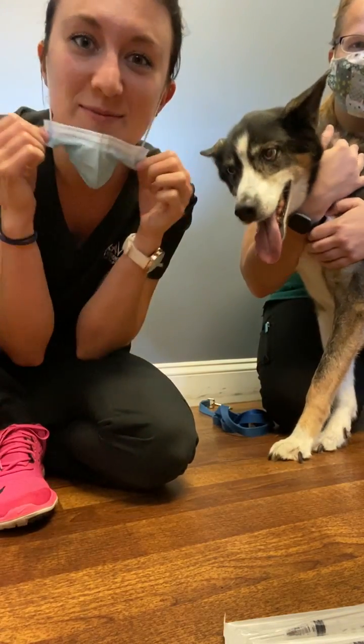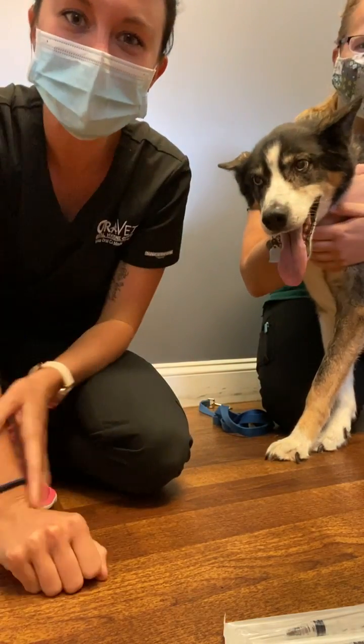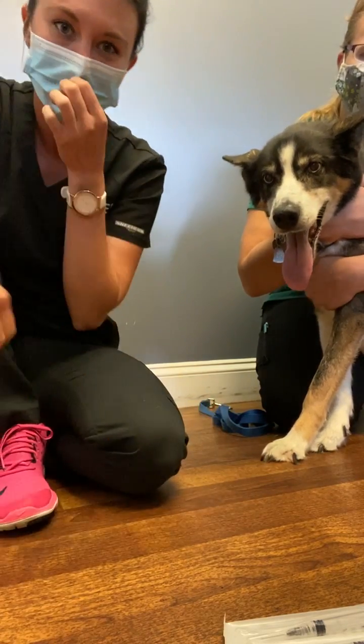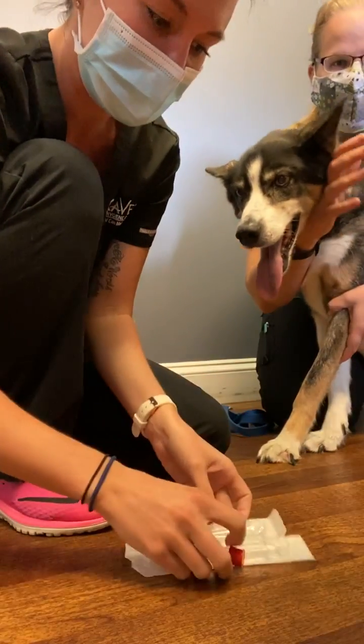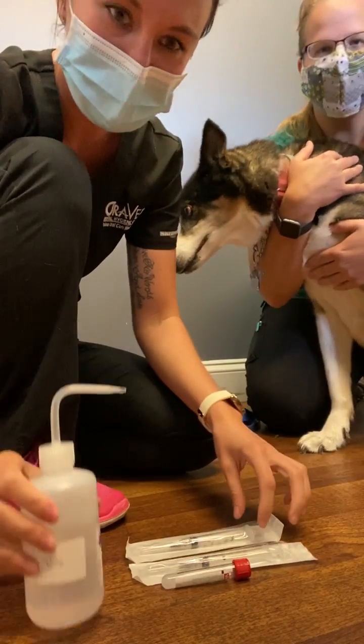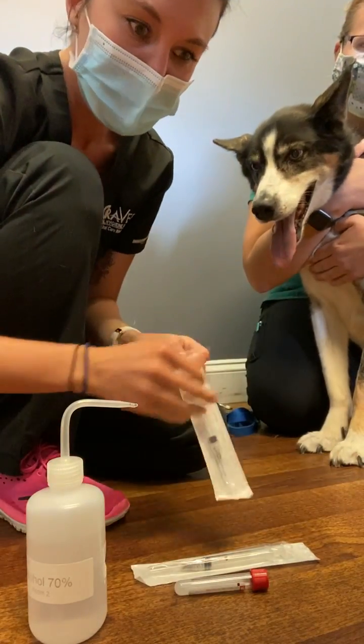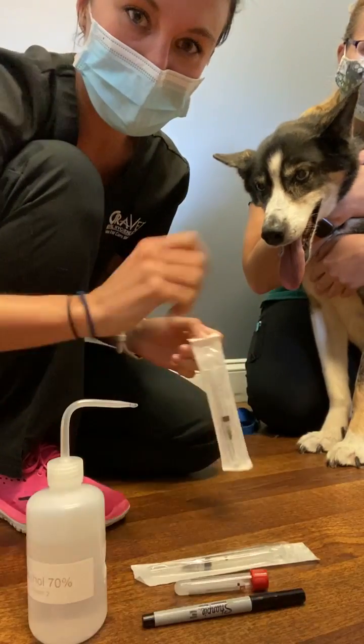Hi, this is Jessica Fox filming for VETT 219. This task is a cephalic blood draw. I have my patient here and all my supplies: the alcohol, the blood tube, a syringe with needle, and a permanent marker to label the tube at the end.